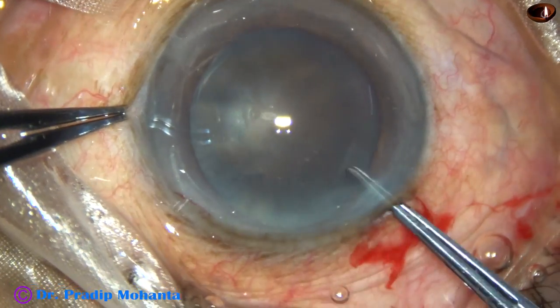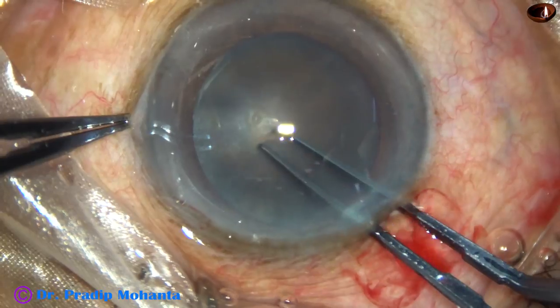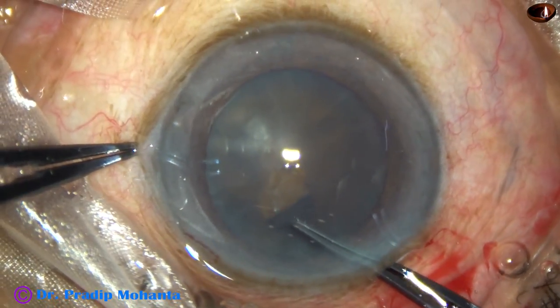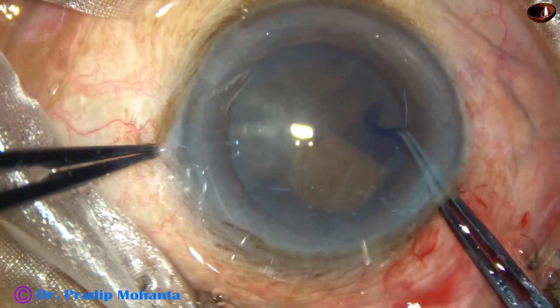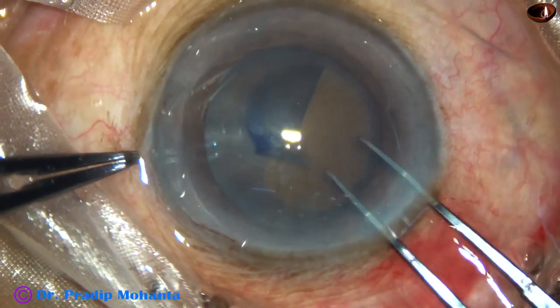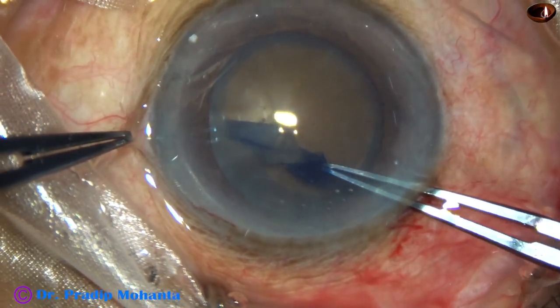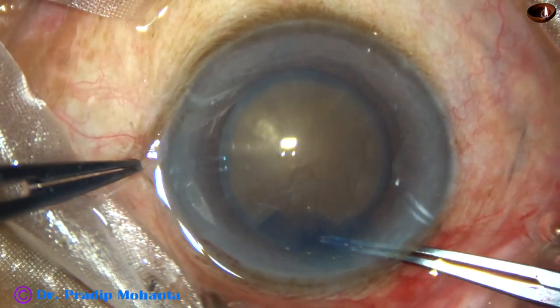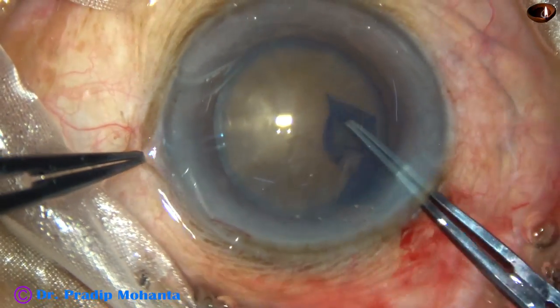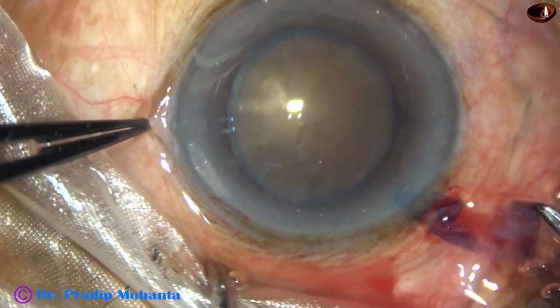Capsulorhexis is now being done with the help of the utrata forceps. The capsular tag is raised by the forceps itself and a large rhexis is done. The size of this pupil is about 6 mm and the size of this rhexis is about 5.75 mm, almost 6 mm.